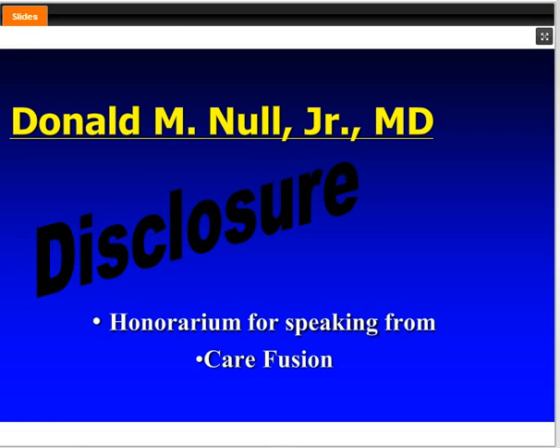Well, the high-frequency oscillator is a fabulous ventilator, but how you use it is what makes it a fabulous ventilator. If you don't use it properly, it's no longer a fabulous ventilator. Well, what is high-frequency ventilation? It's typically considered a means of ventilating patients using very small tidal volumes that are typically equal to or less than the dead space volume.